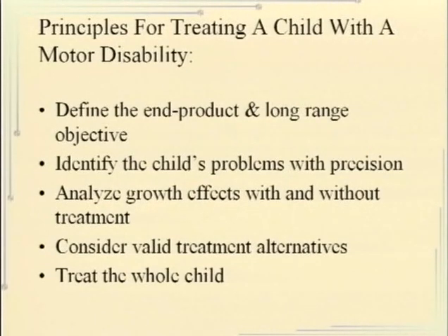But if you're not sure, it could also involve sending that patient to an instrumented gait analysis laboratory. And I think Dr. Sikowski talked about that the other day, where they put markers on the hips, knees, and ankles, and then follow the progression of that individual back and forth along a walkway and feed that information to a computer so that can be analyzed in terms of angles and force vectors at the knees, hips, and ankles. And sometimes when we're planning an orthopedic procedure, that's a critical piece of information that will help the orthopedist decide which muscles to cut and which ones to leave alone, which is very important.